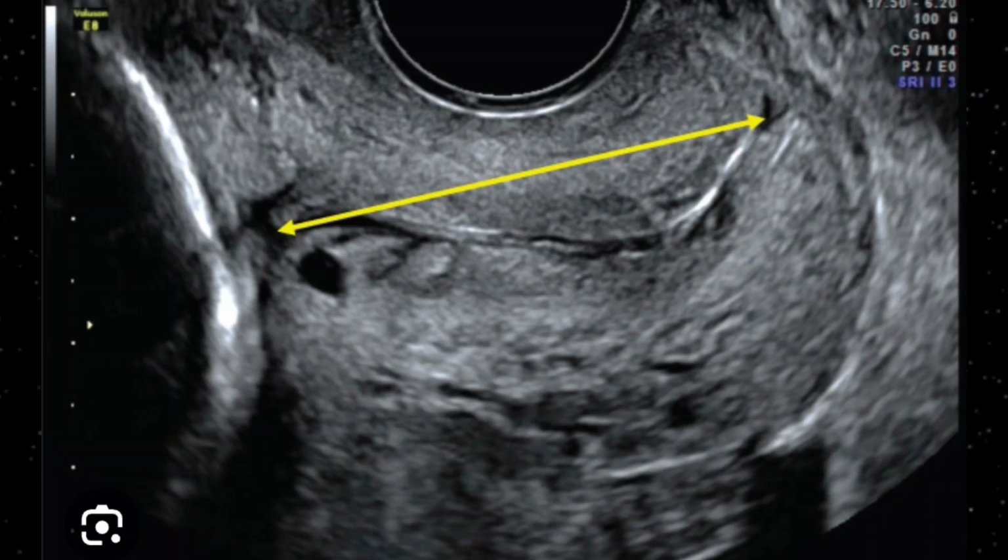On this slide, you can see the internal os, which is visible clearly. You can see the external os, which is also visible clearly. This image is a transvaginal image. The cervical canal is clearly visible. You can appreciate the endocervical canal. So this is the method by which you can measure the cervical length. Cervical length is quite easy to measure.